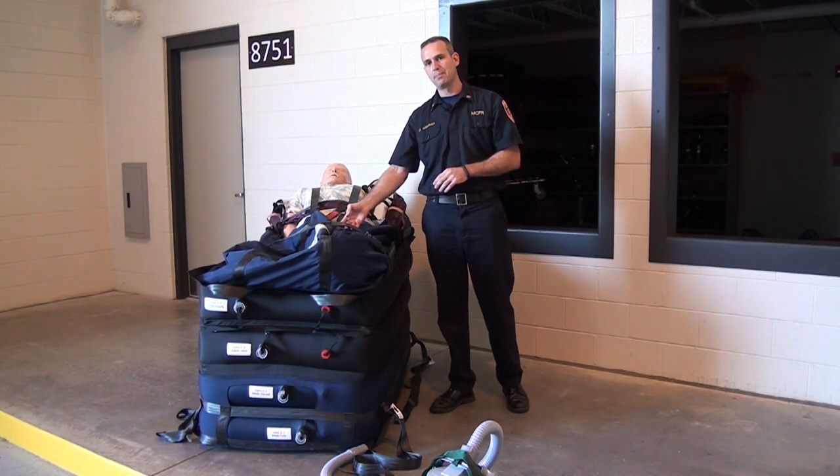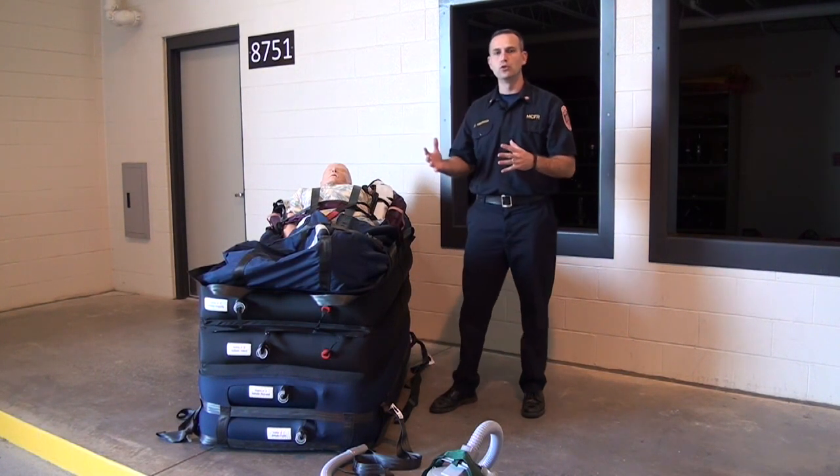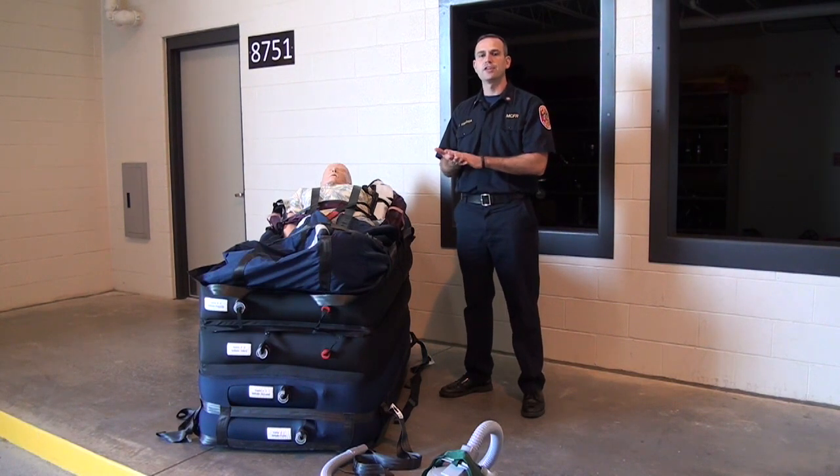It's also important that, just like the hover mat, when we first put the straps on the patient we leave them loose. If we tighten down the straps and then inflate the air chambers, we'll end up compressing the straps onto the patient as we inflate the air chambers.